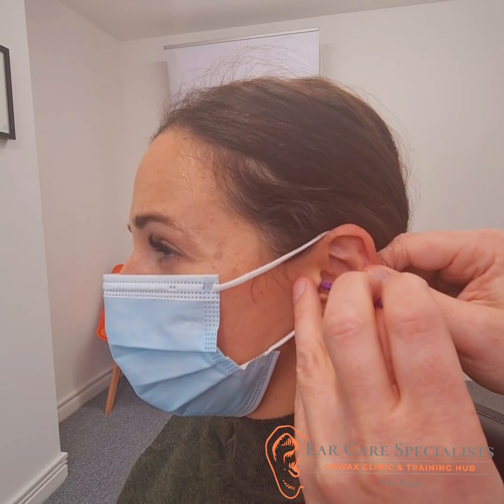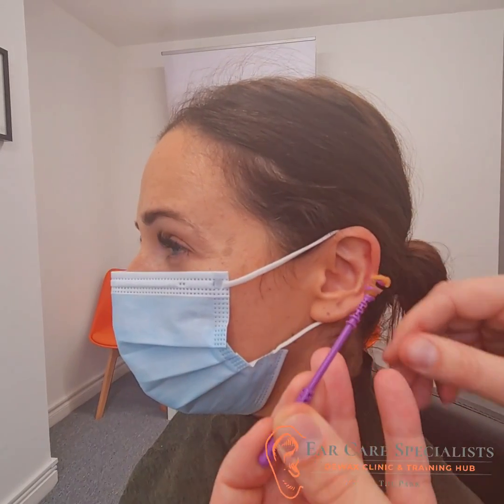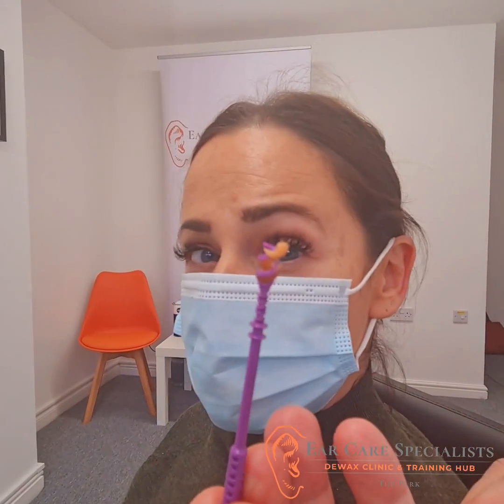I'm just going to give it a little pull. That's it. So that's got the wax out there.